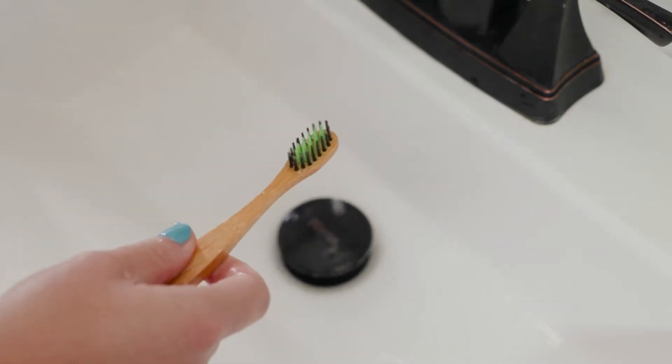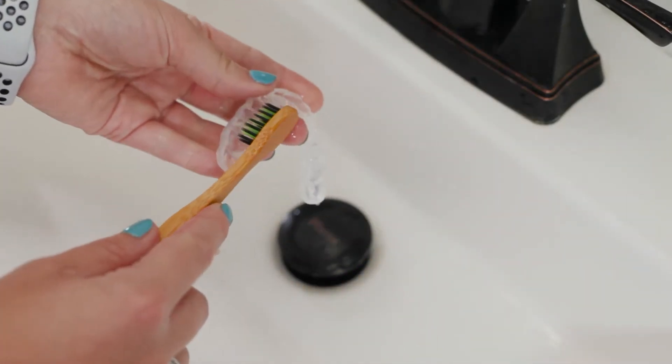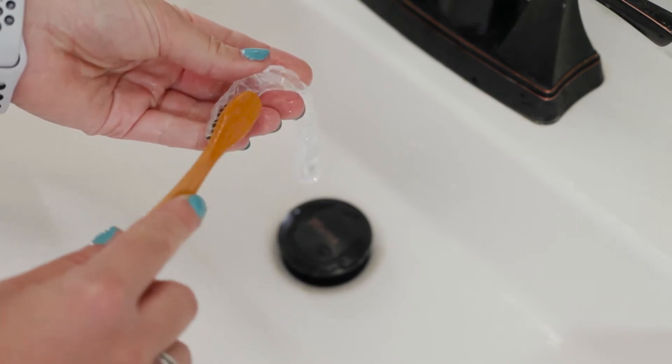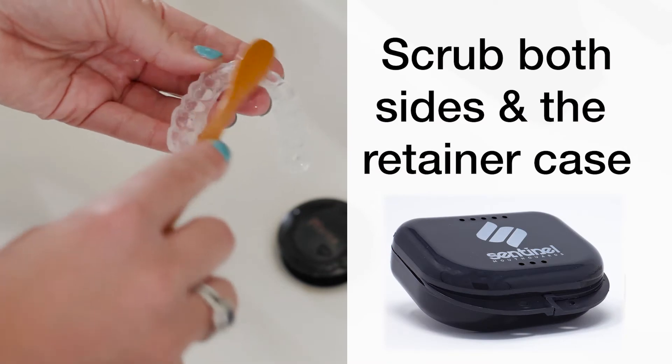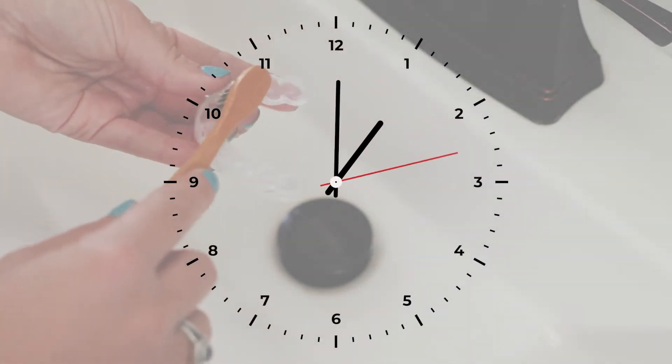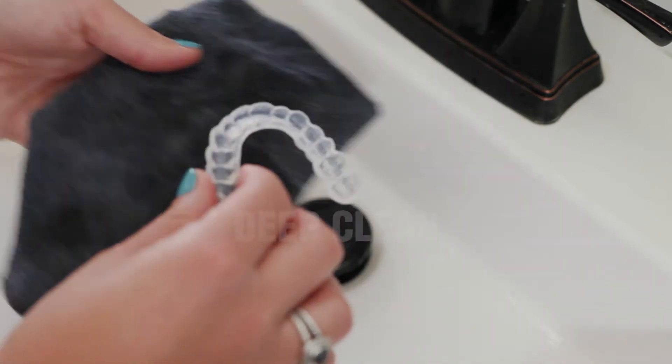Once your toothbrush is wet, apply a dollop of mild soap. Brush in a circular fashion, scrubbing all the tooth compartments. Remember to scrub the back and the retainer case as well. Be sure to brush at least 20 seconds for optimal results. This simple cleaning method takes less than one minute to complete.